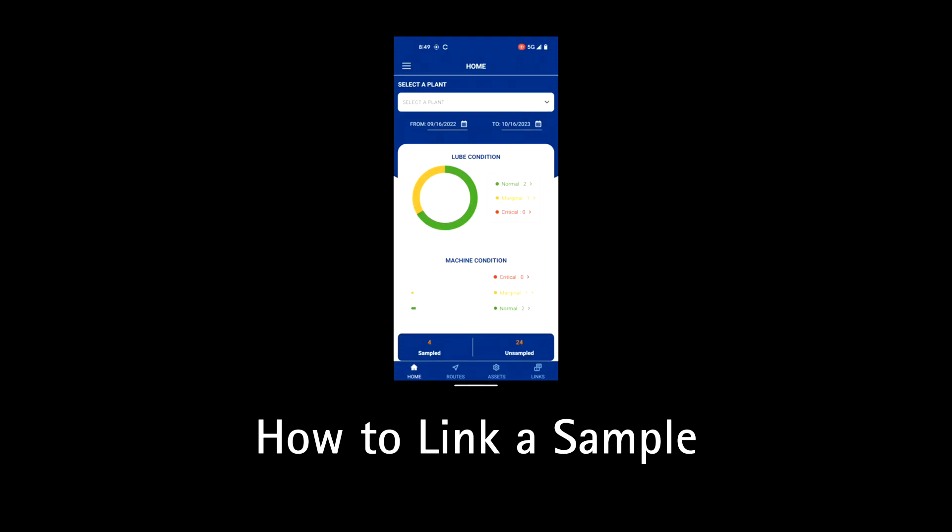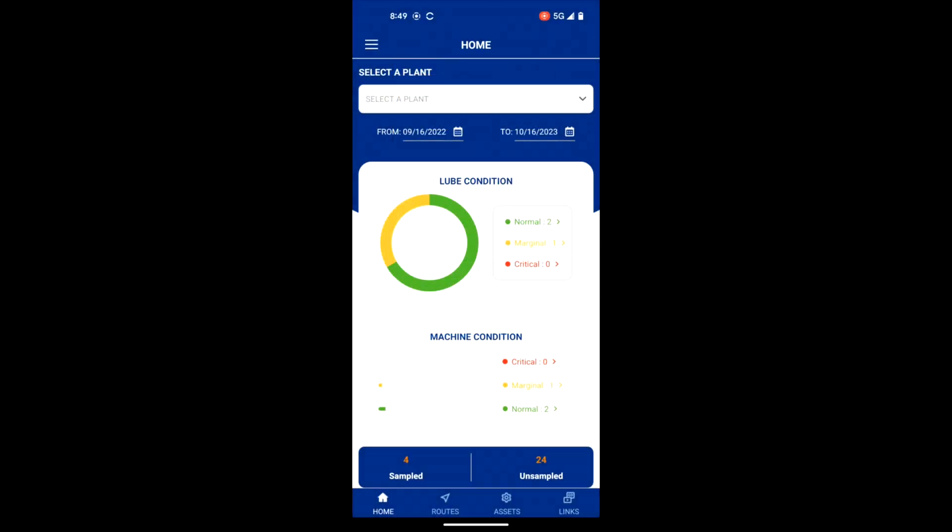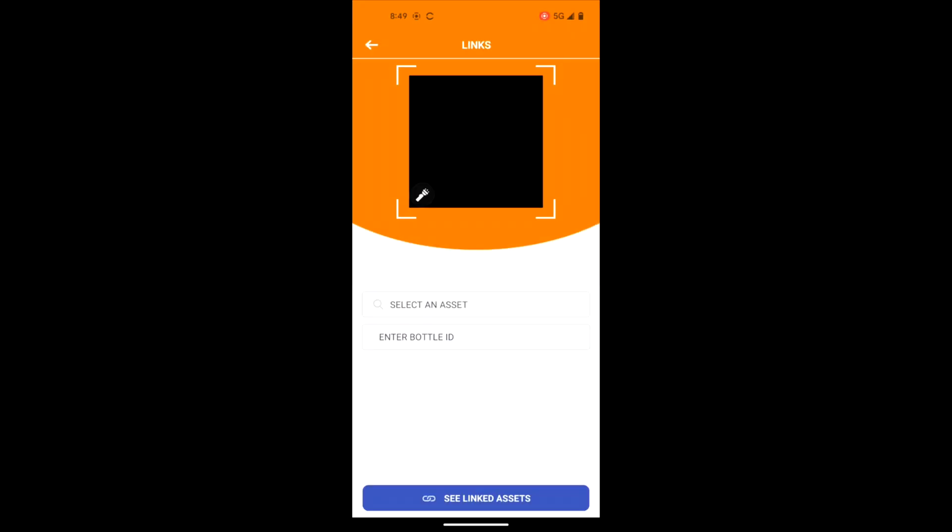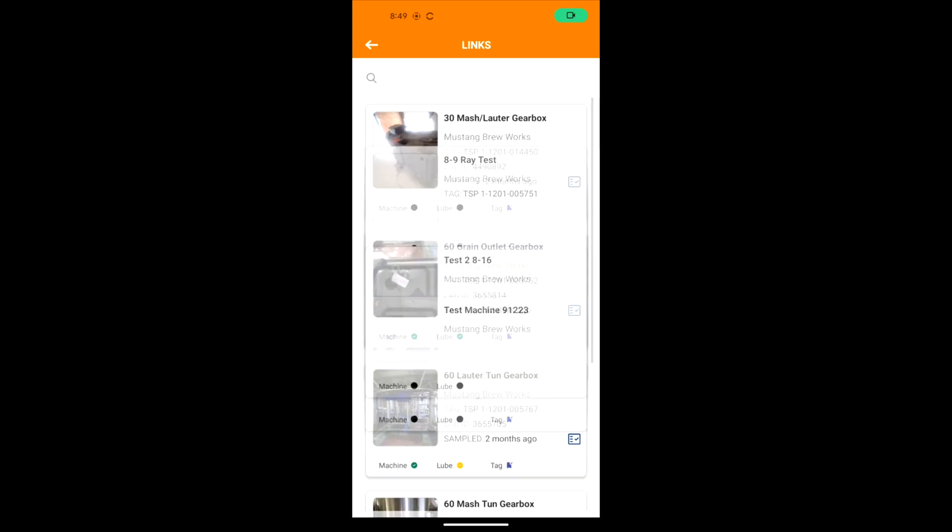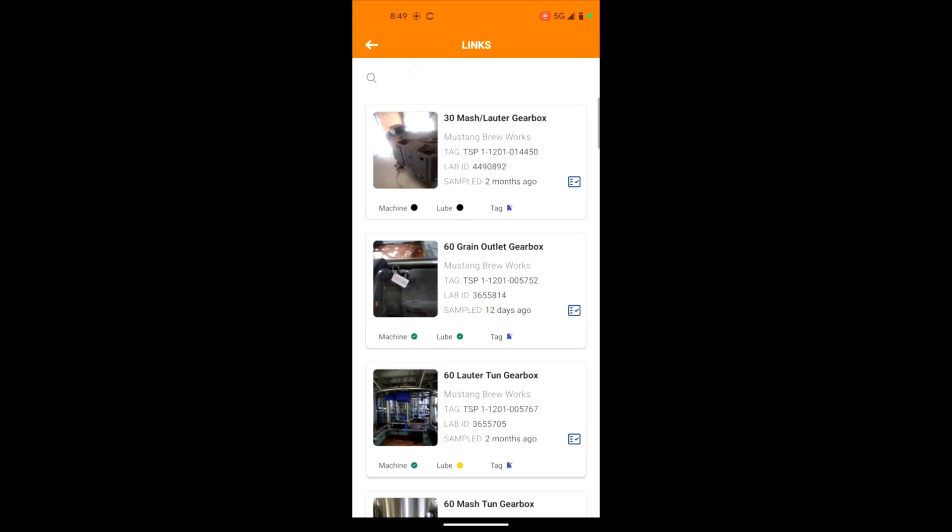How to link a sample. Navigate to the link screen at the bottom of the page. There are three ways to select an asset on the link screen.